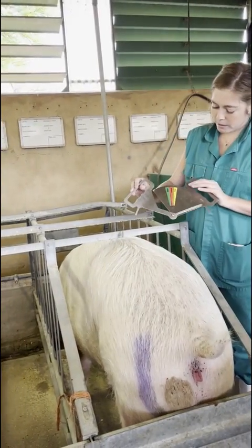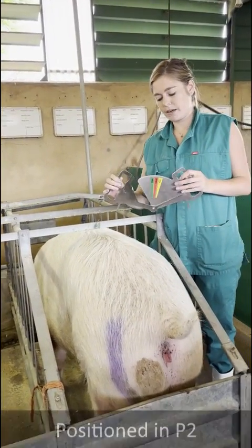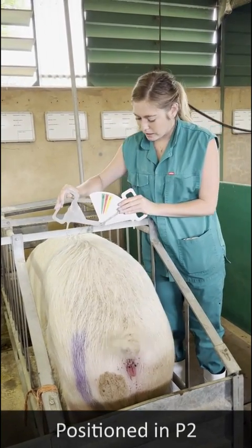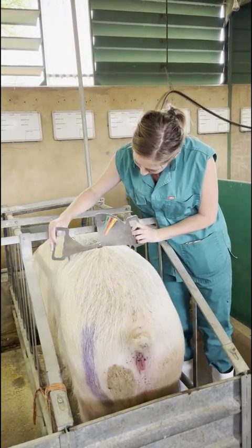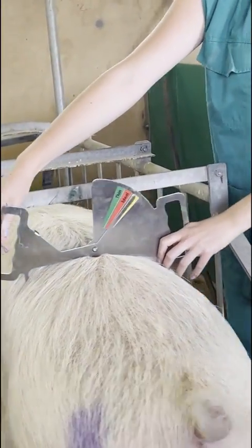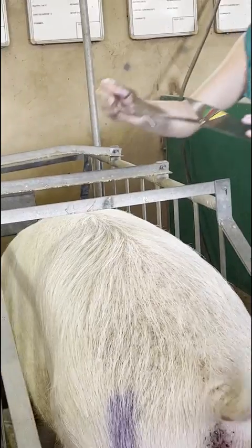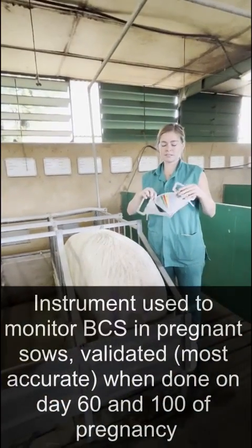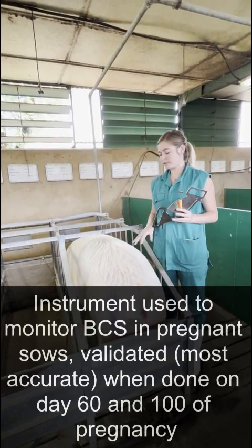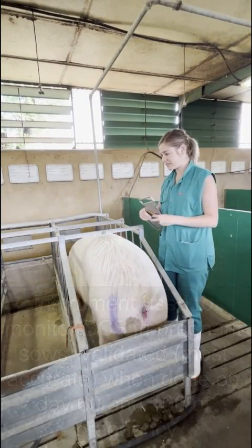The next method is the caliper. The caliper is placed in that same position as you palpate — over there. As you can see, it falls between ideal and fat. However, it should be noted that this caliper is calibrated for a pregnant sow, so it is going to be a little bit inaccurate in a non-pregnant sow.